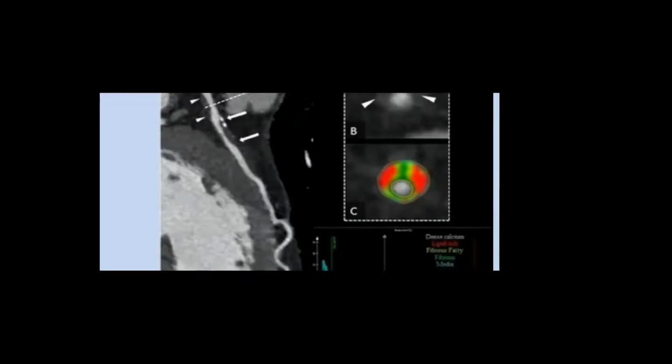Okay. Now, there is another factor which is again important in atheroma assessment, that's called positive remodeling. Positive remodeling means initially when the atheroma accumulates in the wall, the entire diameter of the wall increases before it decreases. How can I calculate the positive remodeling here?